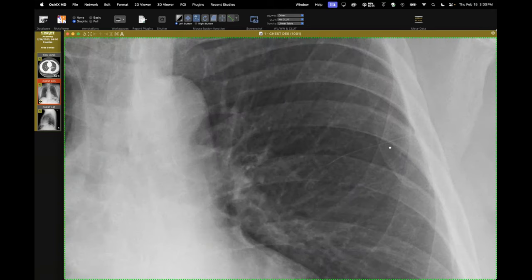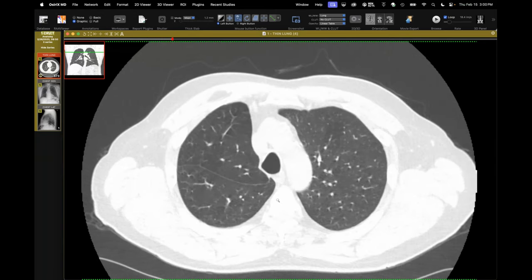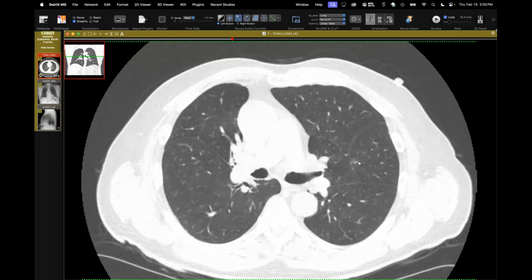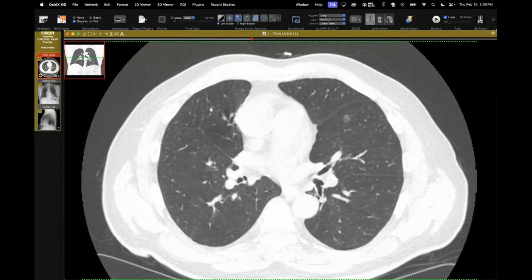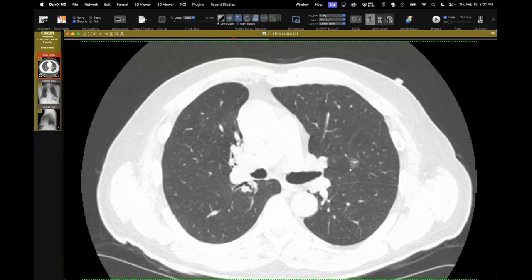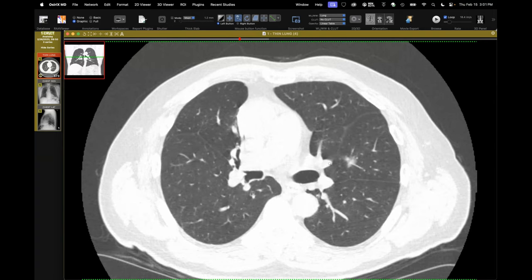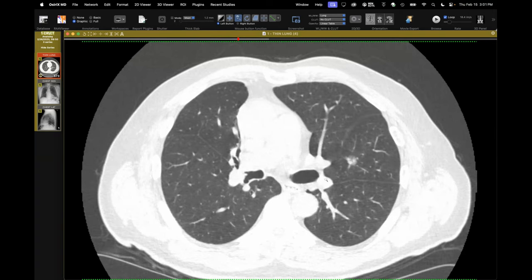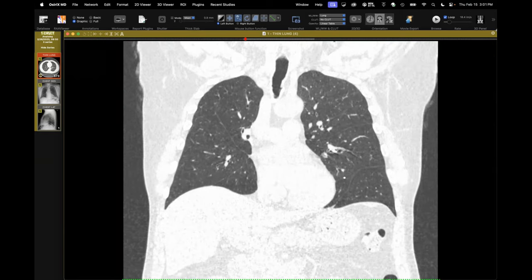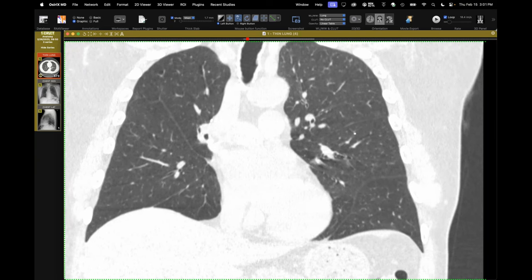This was just a lung nodule surveillance CT. The patient has already had an upper lobectomy for one cancer. Look at this horizontal fissure on the left — it's pretty much complete. There's a presumed lung cancer there and a little friend down here. It goes all the way down, nicely separating the entire lingular segment from the rest of the upper lobe, with maybe a tiny gap right in here. In theory this would make a fairly easy lingulectomy surgery since you already have a fissure. I've not seen a true left middle lobe, but this is the exception to that rule.